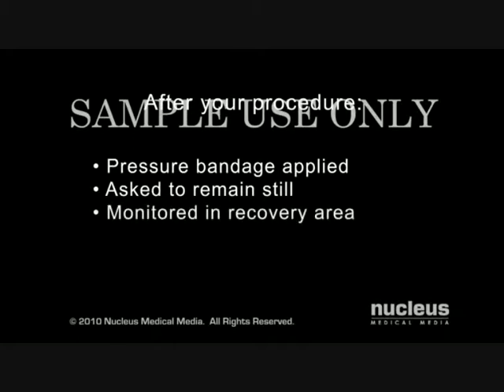After your procedure, a pressure bandage will be applied to the catheter insertion site, and you will be asked to lie still to prevent bleeding. You will be carefully monitored in the recovery area to be sure blood flow through the affected artery is maintained. Most patients are discharged the same day as their procedure, but some remain in the hospital 1 to 2 days for observation.